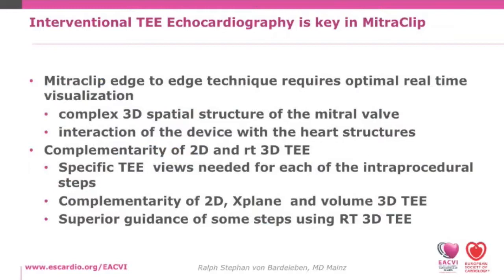So MitraClip edge-to-edge technique requires optimal real-time visualization. You've seen that we have complex 3D spatial structures of the mitral valve. There's an interaction of the device with heart structure that we'll see in the upcoming slides. There's a complementarity of 2D and real-time 3D TE. So in some cases, we want to have very high resolutions.